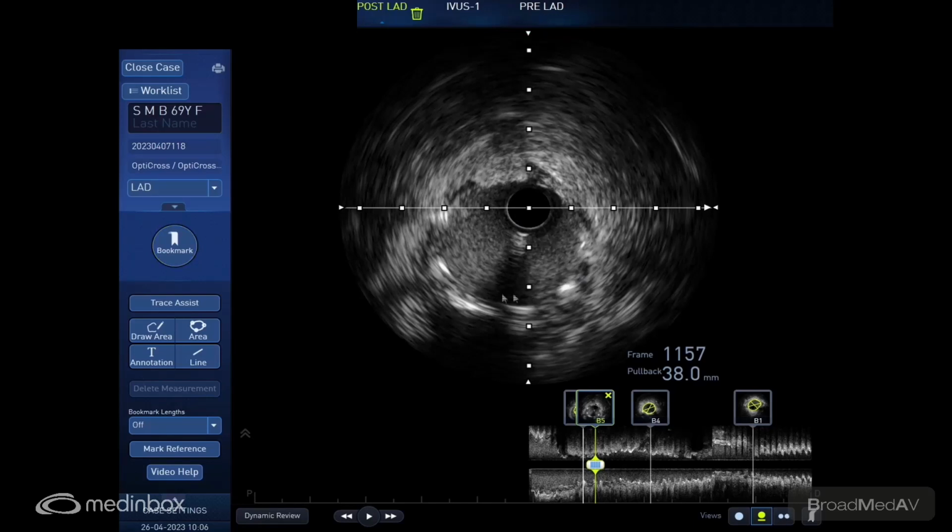So what we're doing now is, as I'm going to go ahead with that tight high pressure, you can see that there's some resistance. I pull out the diagonal wire. It's a hydrophilic wire, so we don't want to get that trapped. I've removed that. Diagonal was looking good, so I don't think we'll have trouble. And we just go in the proximal LAD, proximal os, only with the 3.5 and try to get a good result. 8.2.